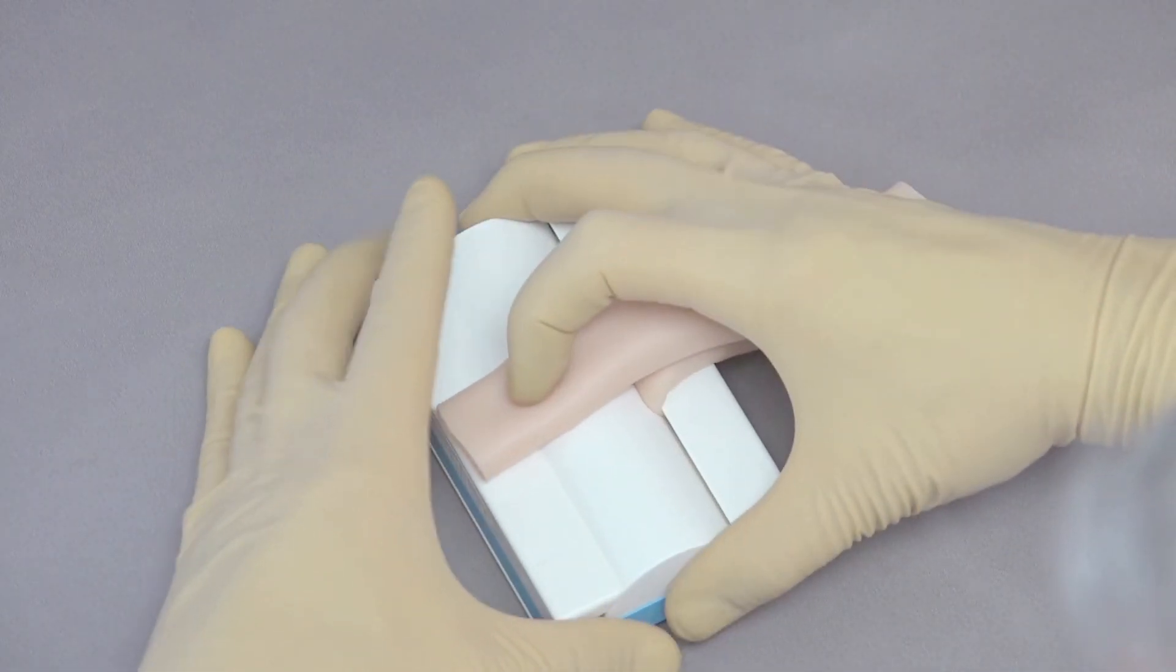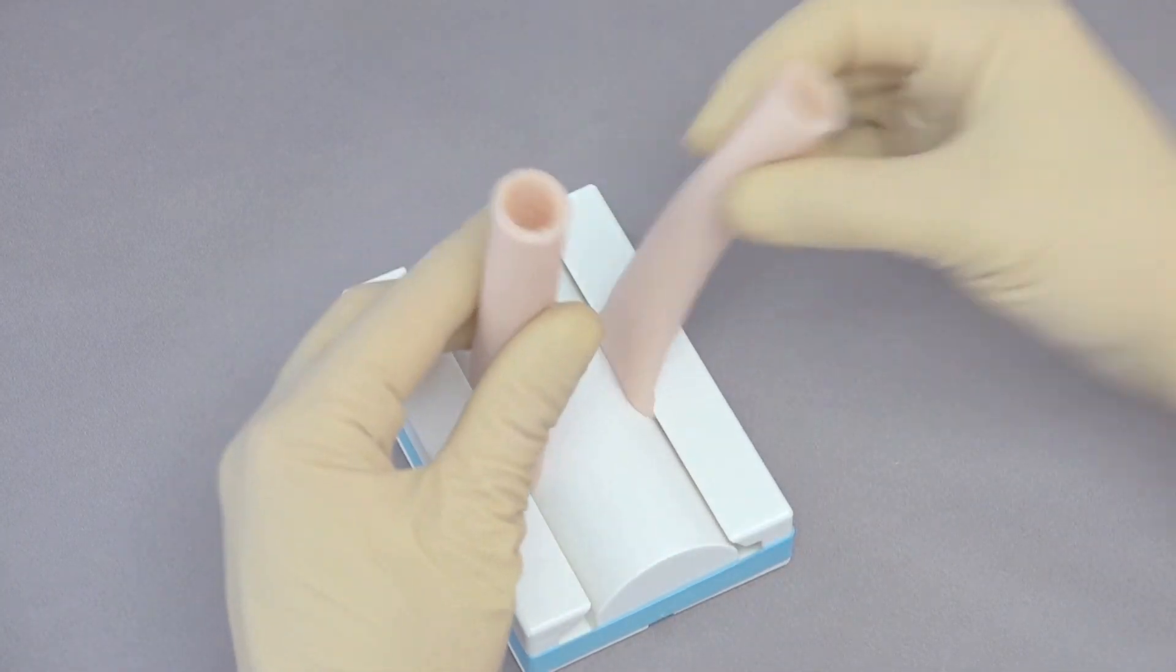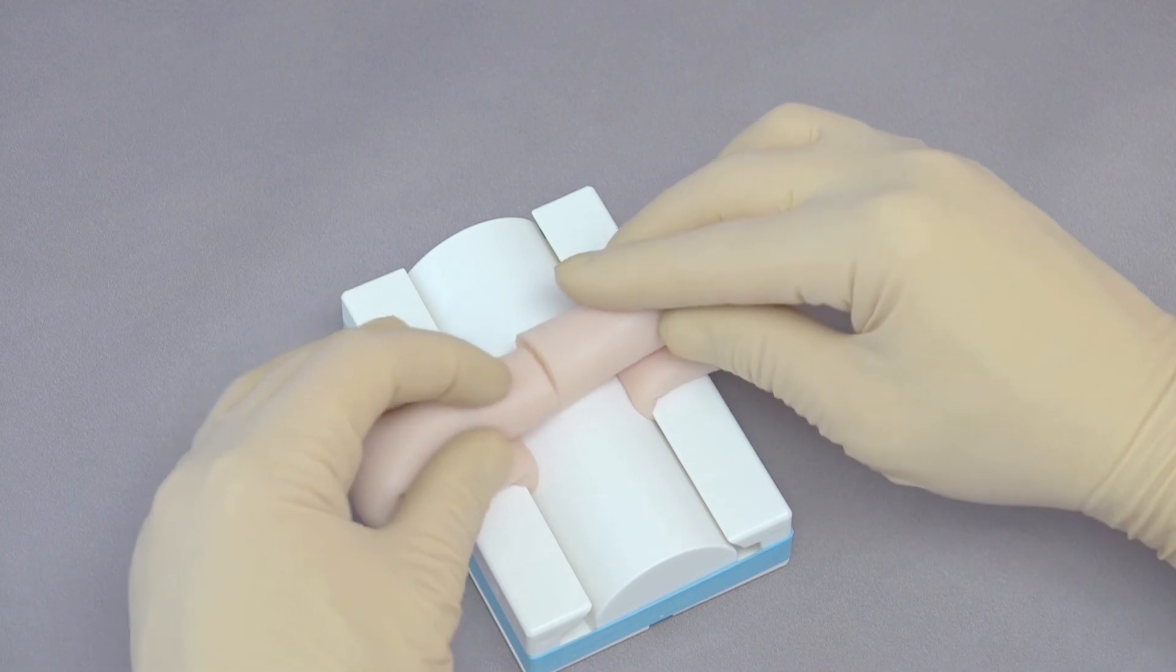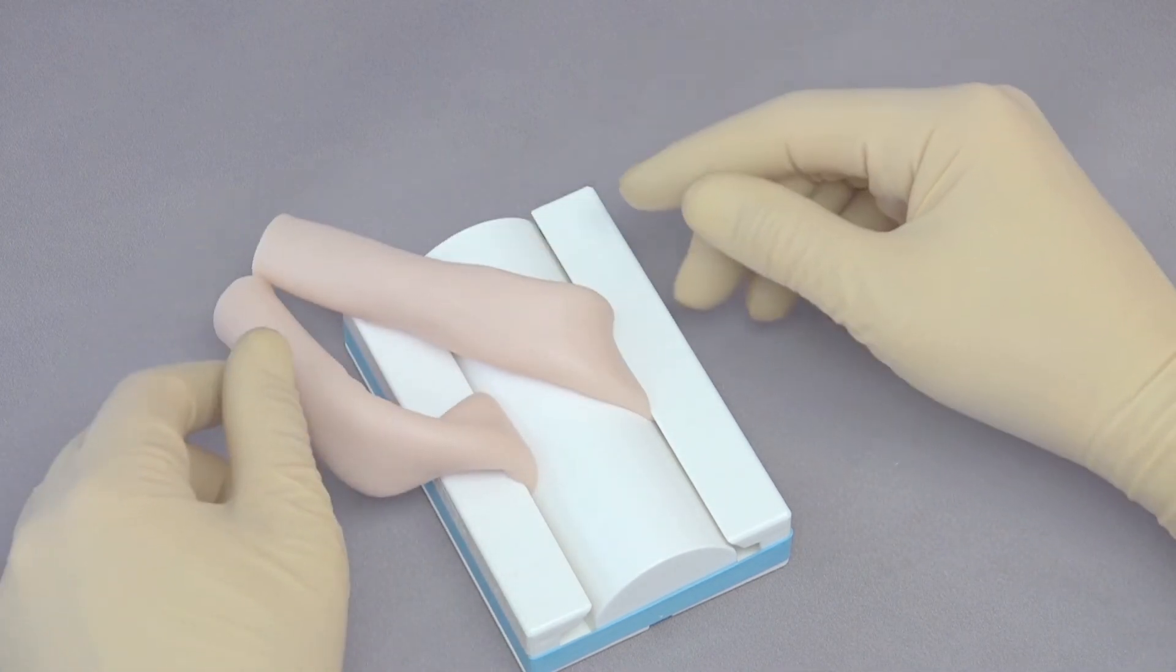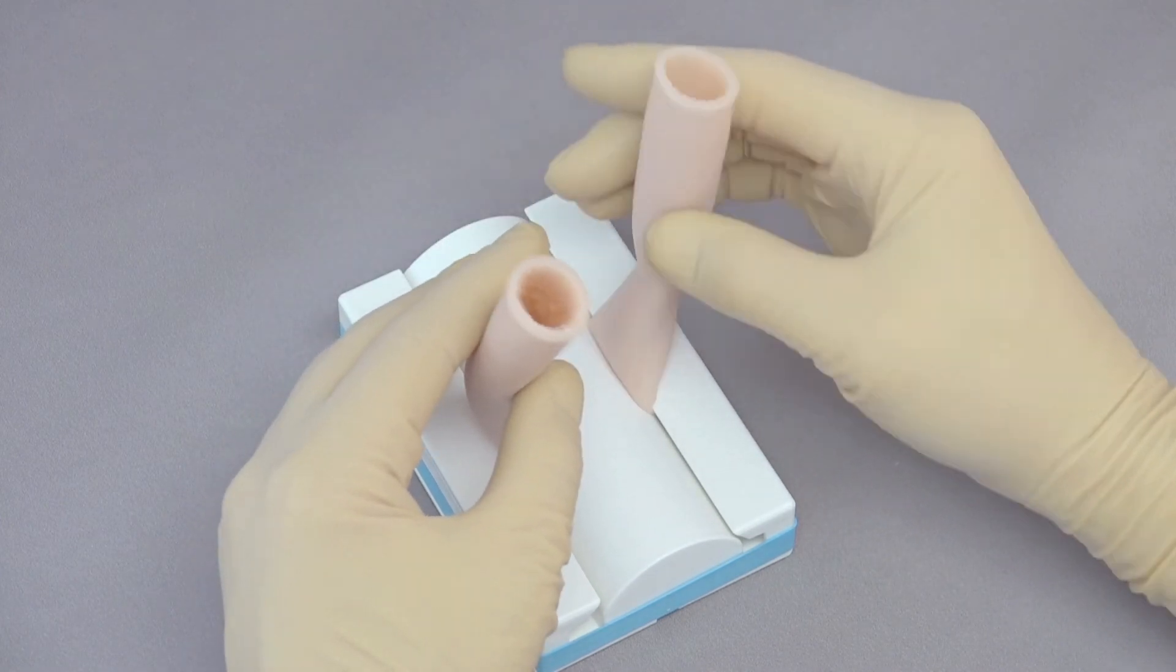Setting it on the side, opening with my left hand, with the right hand pushing it in place. Now I've got the intestine that is stabilized so that I can do an anastomosis. The Tensioning Base works very well. You can do these without that but it seems to be a lot nicer to hold it together.